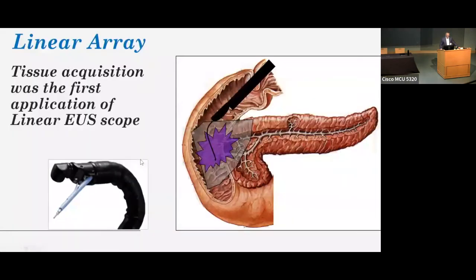So for tissue acquisition, that started by having the endoscopic ultrasound, the linear one, the EUS. As you know, how it developed initially, we had the radial. So we're just looking. And 1995 to 2000, what people used to do is that they just used to learn how to utilize EUS. And then linear came after that. If you trained with some of your physicians who have been doing EUS from the beginning, you'll find that they were more comfortable using the radial than the linear. The new generation of advanced endoscopists are more comfortable with the linear more than radial.